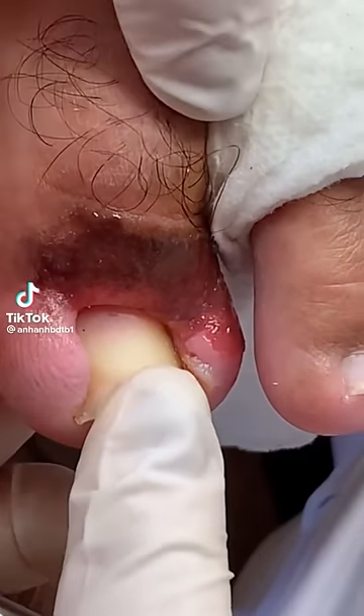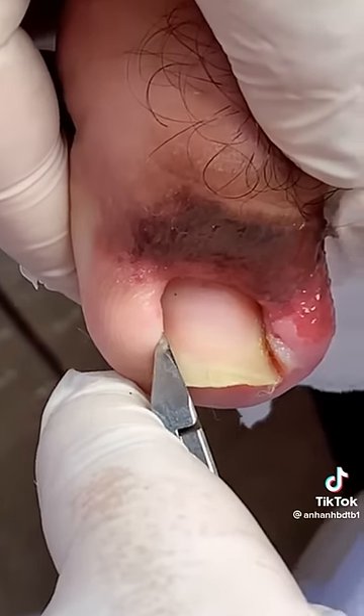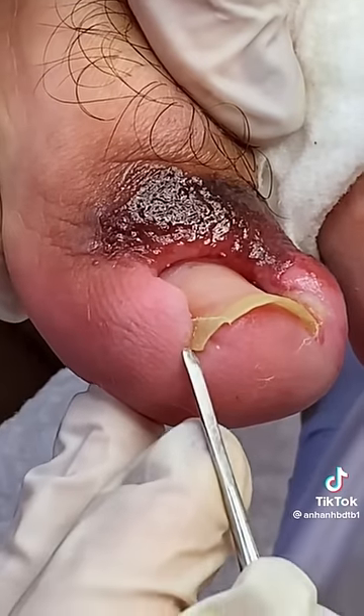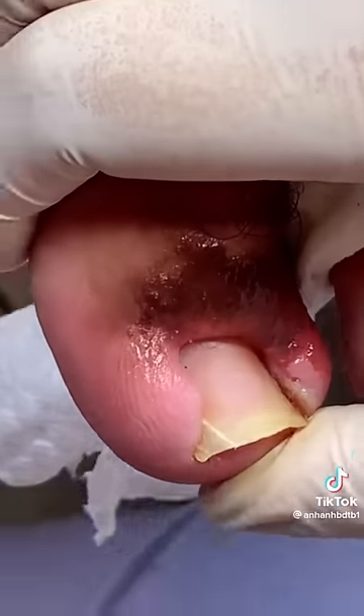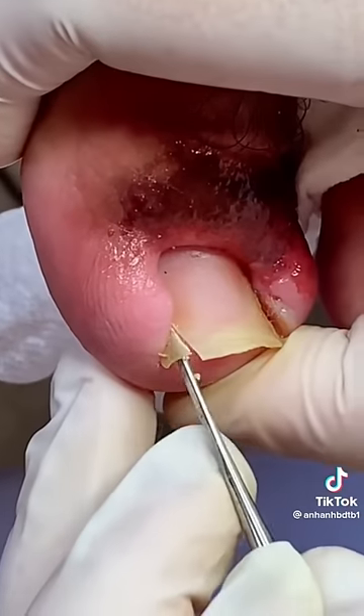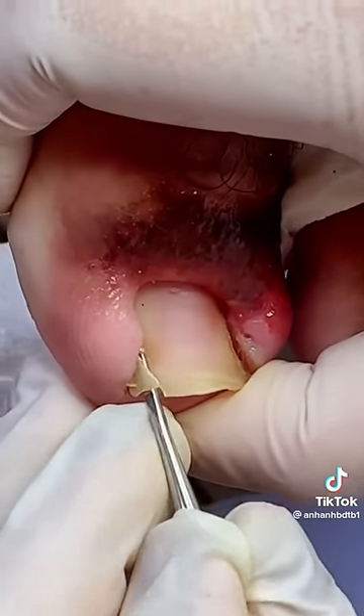Here we have a super satisfying removal of an infected overgrown toenail. They're going to be using a blade to really cut down the side and take a huge piece of that ingrown out. Unfortunately, this is a conservative treatment — it will give the patient temporary relief, but in a few weeks or months that portion of the nail will grow back.